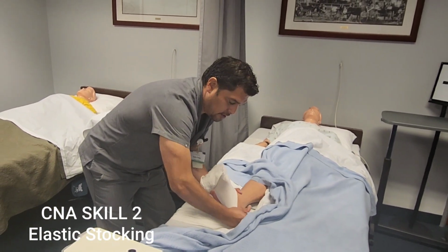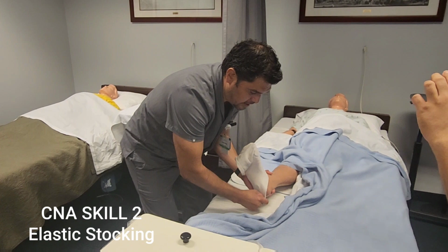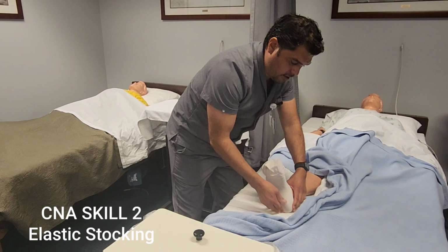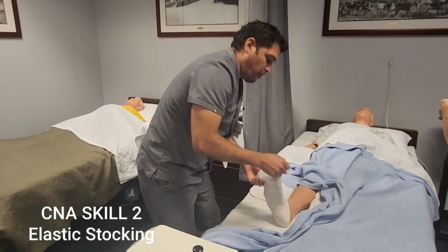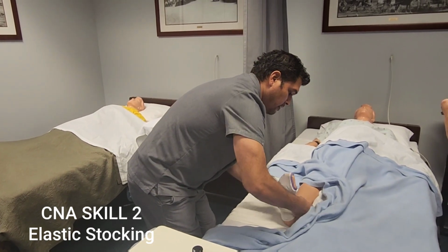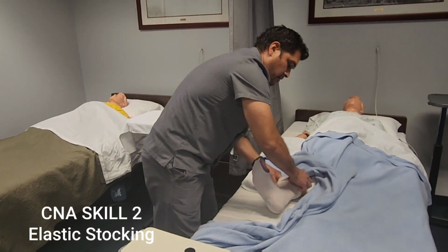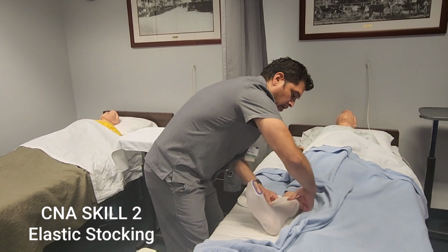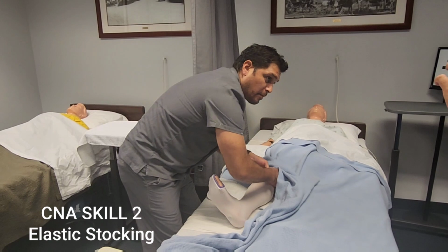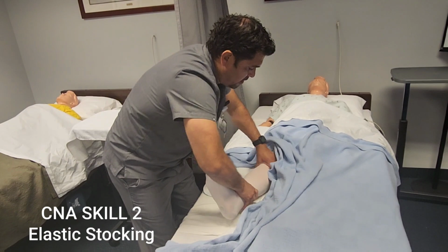I'm going to bring this down to the heel as best as you can get this down to the heel. This foot does not bend. So now I have this right here, so I can place the glove of this over the sock of this over the foot. All right. You're always going to want to place, when you get an order, the TED hose. This is always to be put on in the beginning of the day before they begin activities of daily living. So now the sock is right up to where the knee is.